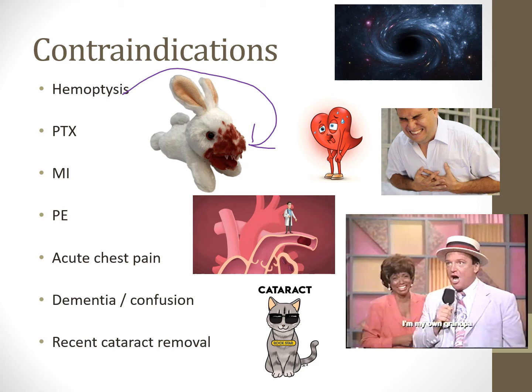But if someone's coughing up blood, they're not healthy enough to be doing a pulmonary function test. That's a patient whose lung function we're going to look at in other ways, like an x-ray, which is still subjective, or a CT scan of their chest. We're going to look at their lung function in other ways, but we're not going to have them breathe deep into this device if they're coughing up blood. That's not a good sign.